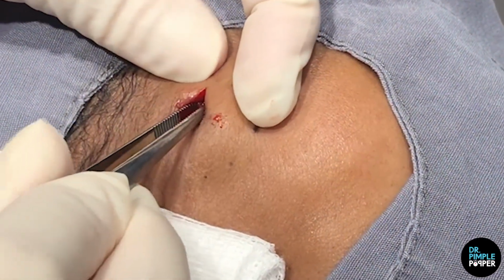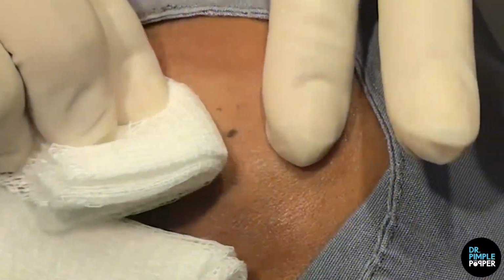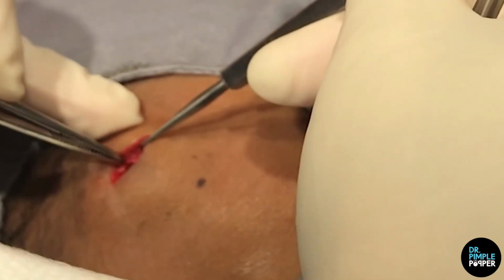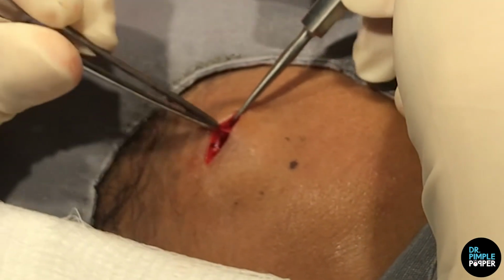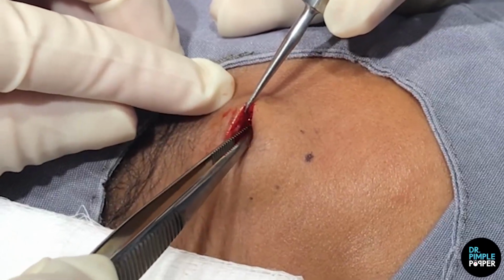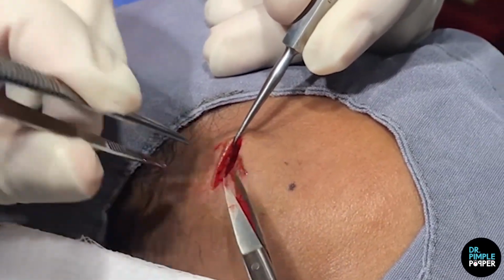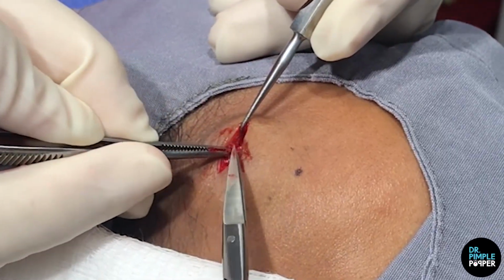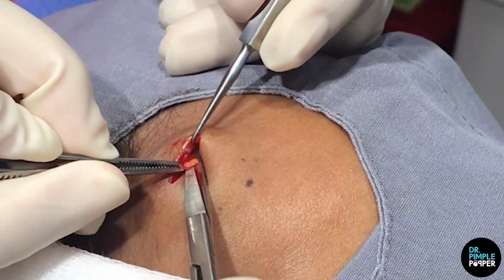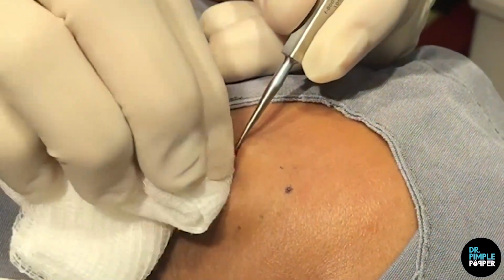Yeah. I just want to make sure I got it all, and you know how that means I have to just sniff around here a little bit, as you know, girls. But there you go, this back again, thank you. There's like a little, the muscle overlying it, just trying to get all the edges here. Just have to be meticulous and do it. No real shortcuts here. Okay.